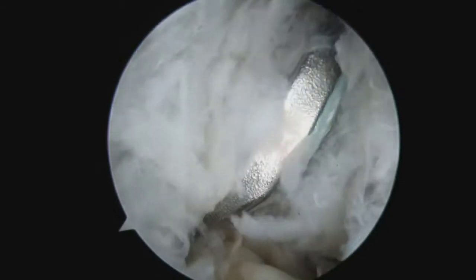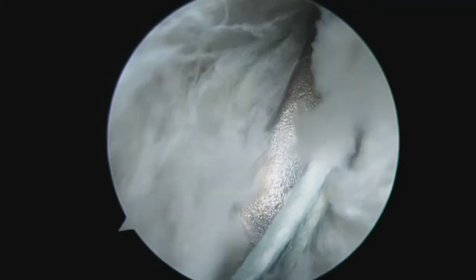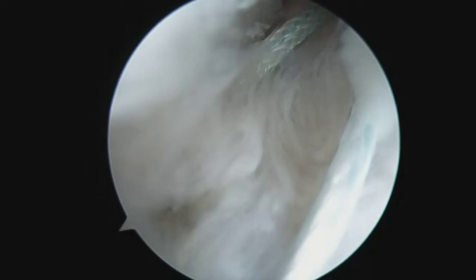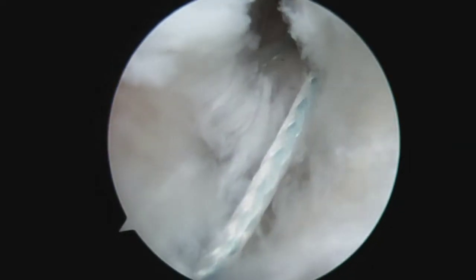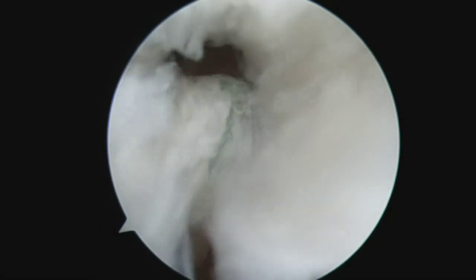A suture passer is inserted through the medial midtarsal portal. Suture loops are inserted into the ligament flaps. The suture limbs are then paired up.